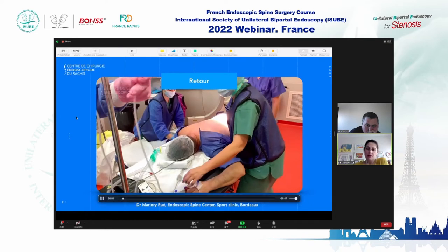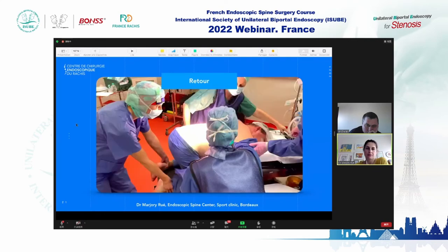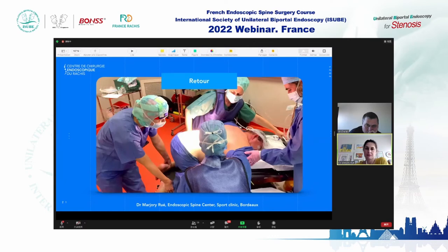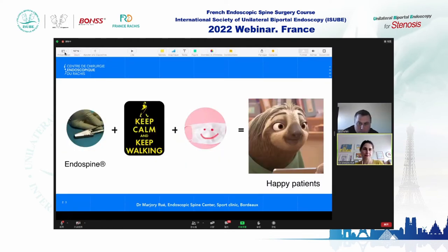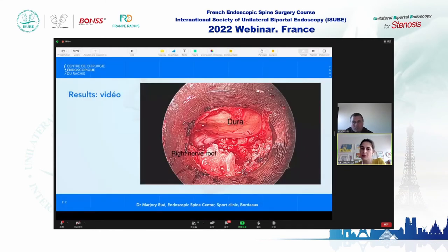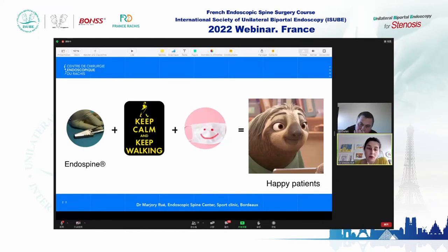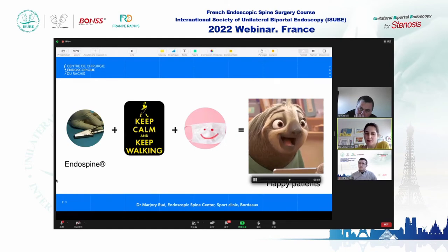After, the patient goes back to bed. This is a screen capture showing the dura at the top and the right nerve root. You can see it is now clearly decompressed with all bony edges visible. As I like to say — whether it is the Endospine or UBE or any endoscopic technique — I tell the patient: keep calm and keep working with a smile. After that, all your patients will be very, very happy.